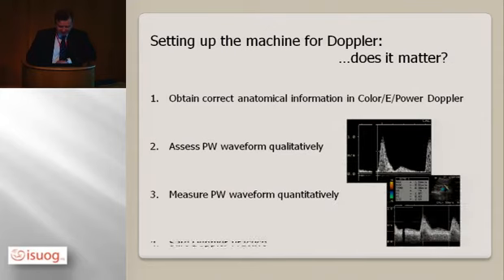But of course, the main application of getting Doppler right and using pulse wave Doppler is to measure the waveform quantitatively. Now, whether that is an RI, or PI, or if you're from the US an SD ratio, or velocity, which could be a peak velocity, time average velocity, TAMX, you then need to standardize the waveforms, because if you don't, the information you get will vary from machine to machine, and it'll vary from patient to patient and unit to unit.